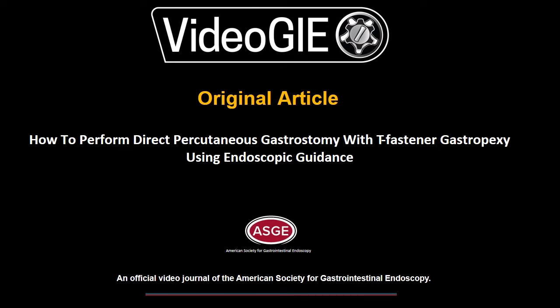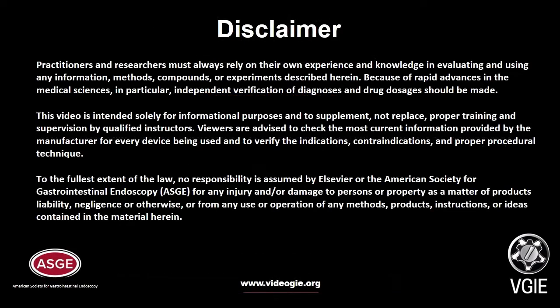How to perform direct percutaneous gastrostomy with T-fastener gastropexy using endoscopic guidance.